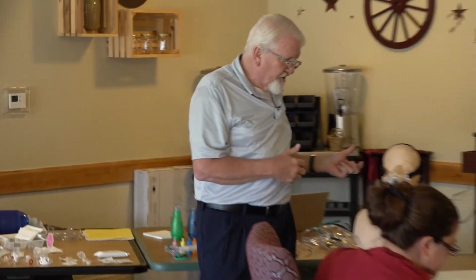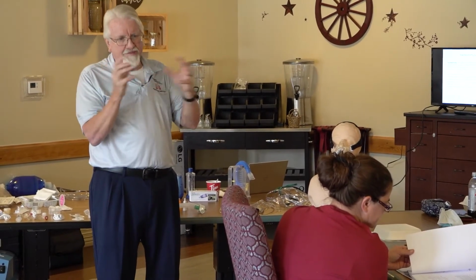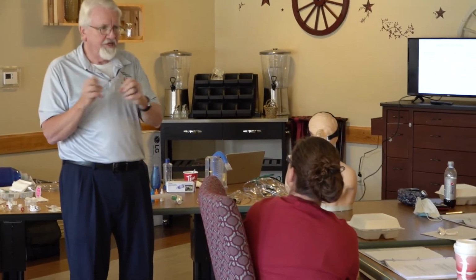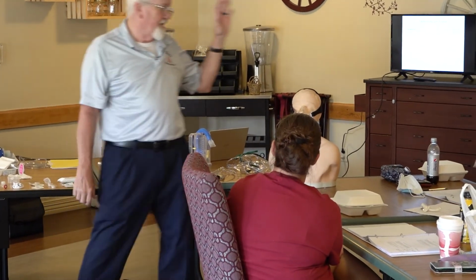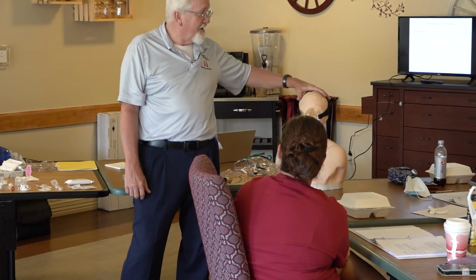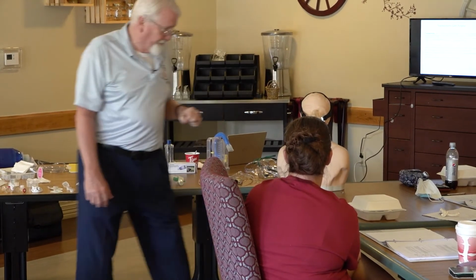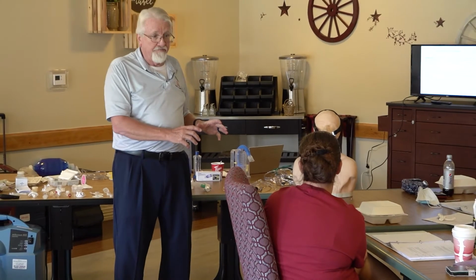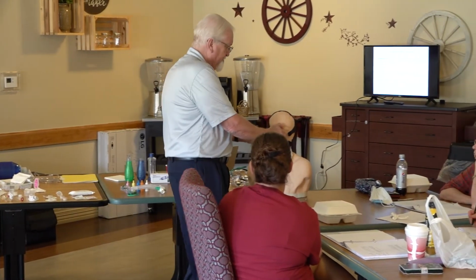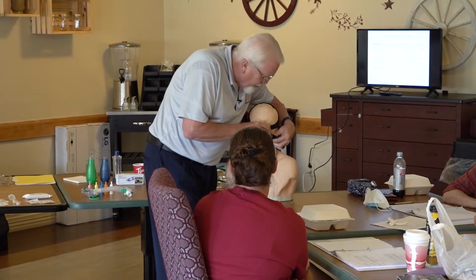So I've got all that stuff, and I've come on into Bob's room, and while I'm talking to him and getting everything together, I've already donned my PPEs and all that. Bob might not remember me from Adam's house cat, so I'm going to remind him who I am, why I'm here, this, that, and the other. And I'm getting everything set up. So the first thing I'm going to do is Bob's on oxygen. I'm going to go ahead and take this off because I just do that for display. He's not going to be on a BiPAP.